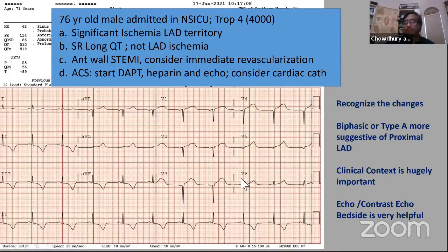Why this happens, we are now learning that this can be associated with some strain on the heart, can be associated with Takotsubo. Could be adrenaline surge and could be inflammatory surge or could be some serotonin surge. Three pathways so far been identified, but you can see this EKG. Best way, always look at the clinical. And your life may be easy on your part not to do cath.